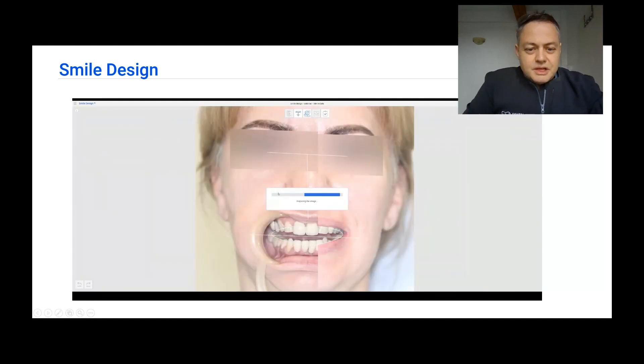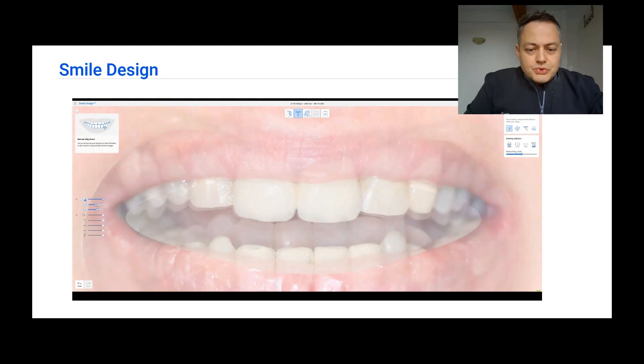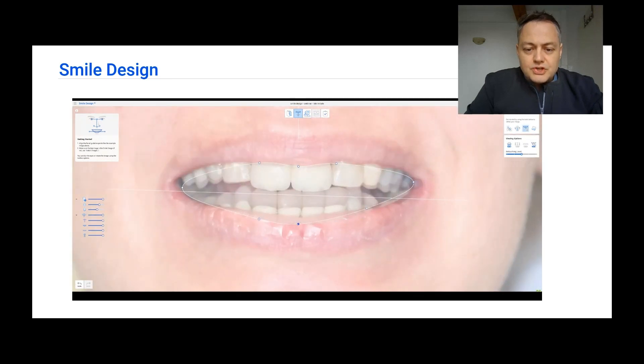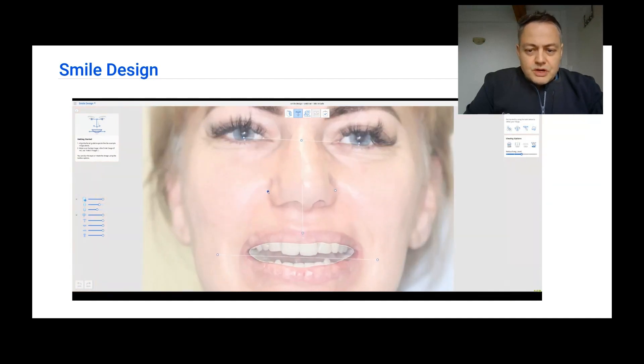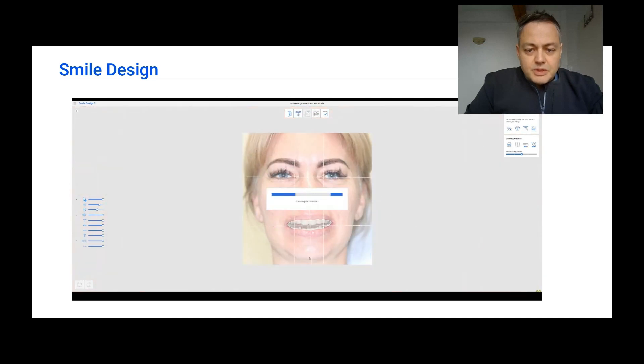Now let us select the photos of the patient — one retracted and one with the smile. We are going to align the photos in Smile Design. We are also going to check that the alignment is properly done by the AI tools of Medit. We are also going to adjust the smile line of the lip, as you can see here, by adding points and by moving them. Once this is done, we are going to see if the lines are generated correctly and play a little bit with them.